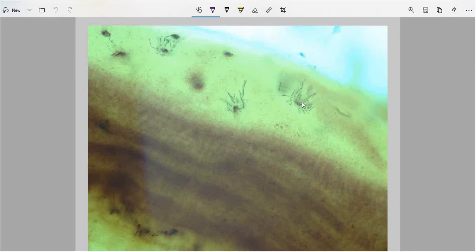In the living tooth, this space is occupied by cells, and those cells are known as the cementocytes. But in the ground section, as no living cells are present, these are empty spaces, and we call these empty spaces the cementocyte lacunae.